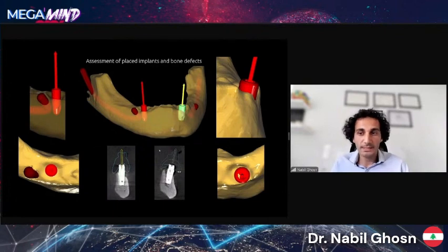As we see, the implant placed in 33 presents a bone defect, but its position is a little bit outside the bone envelope, making bone grafting in this region inadvisable. So it was decided to keep it, but to disinfect it and polish the buccal surface of the implant. But the other implant had a contained defect where we could potentially gain some bone if we graft the site.